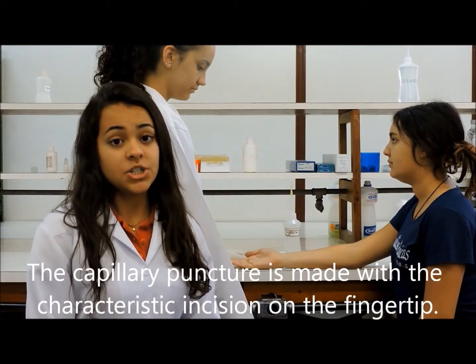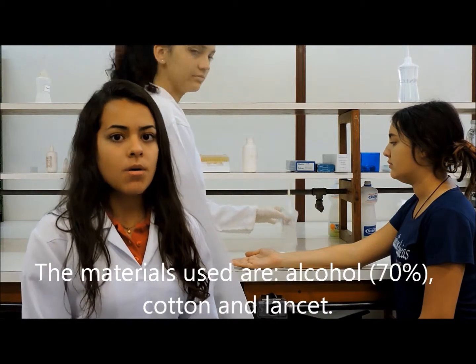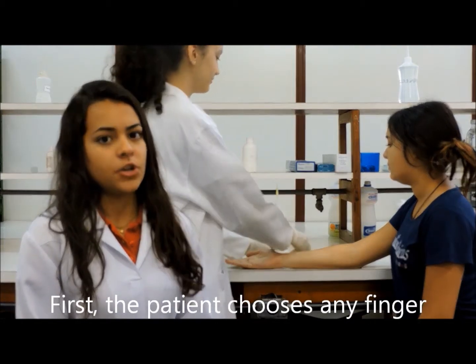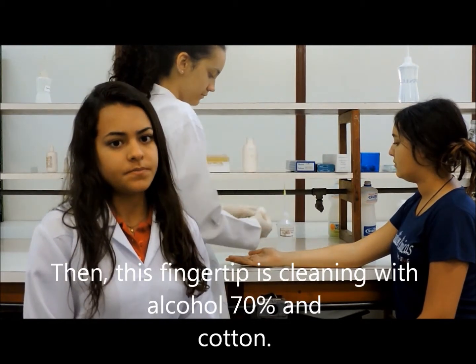The capillary puncture is made with a characteristic incision on the fingertip. The materials used are alcohol 70%, cotton, and lancet. First, the patient chooses a finger. Then, this fingertip is cleaned with alcohol 70% and cotton.